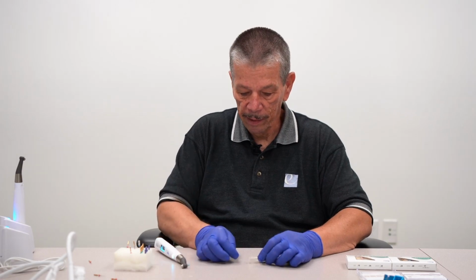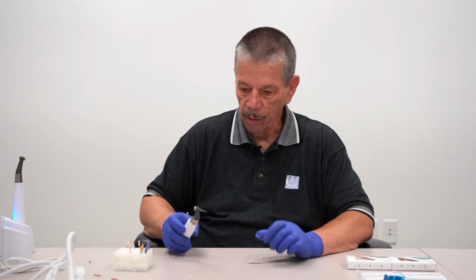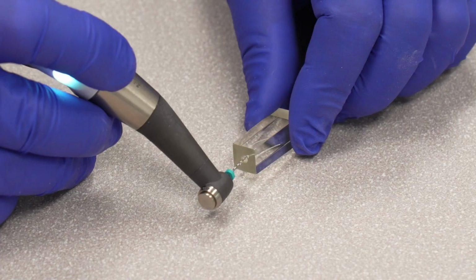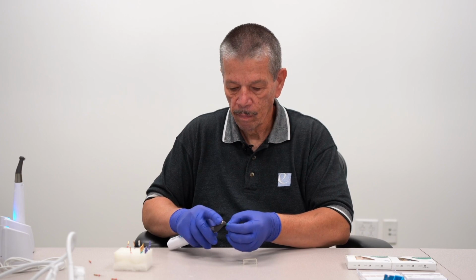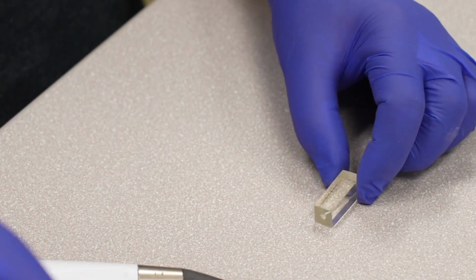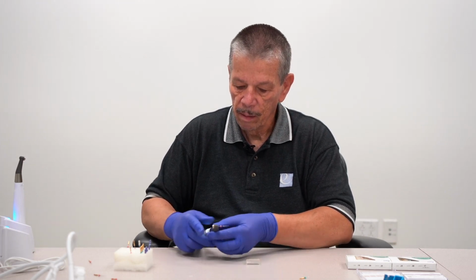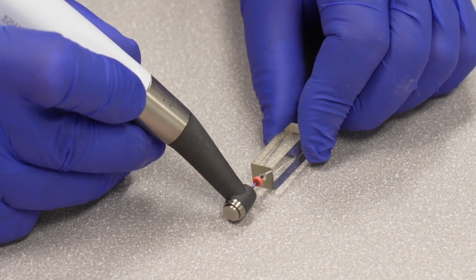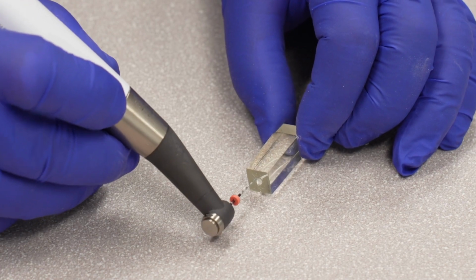Okay, negotiate with a size 10 stainless. Then utilize the Traverse orifice opener, the upper third of the canal. Recapitulate. ZenFlex glide path file, 0625. Clean the flutes.